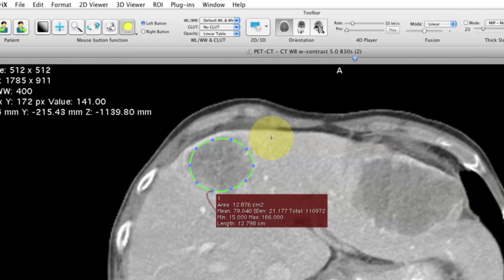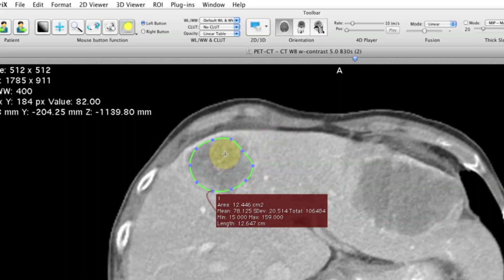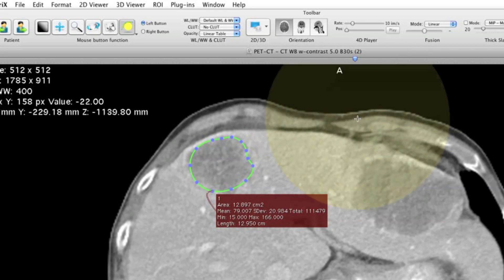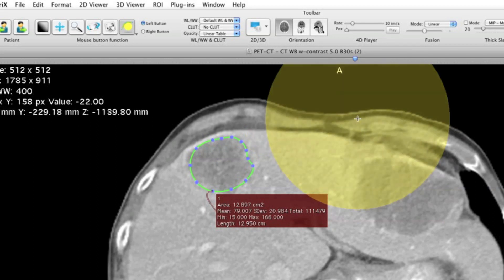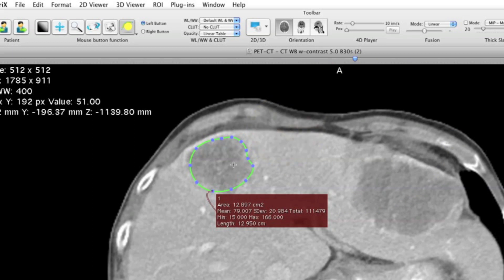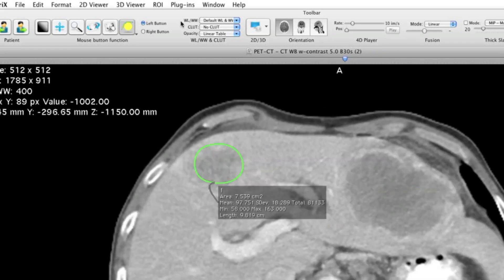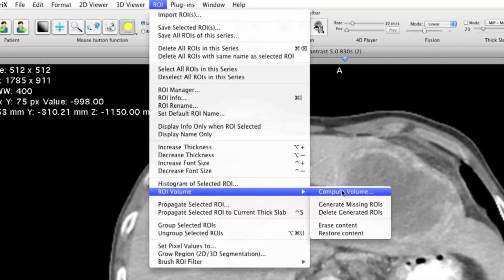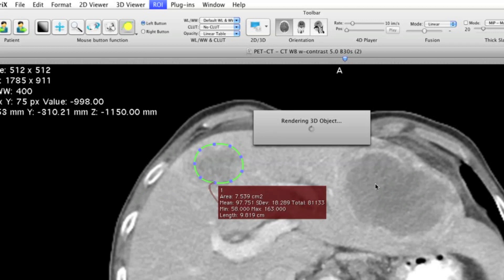Click and hold the left mouse button to push things in or out to get the right shape. The repulsor tool is smart: the closer you click to the ROI, the smaller the effect; if you click farther away it will have a bigger size. When done, go to ROI > ROI Volume > Compute Volume, and OsiriX will compute the volume of your lesion.